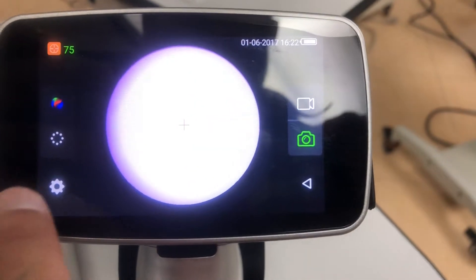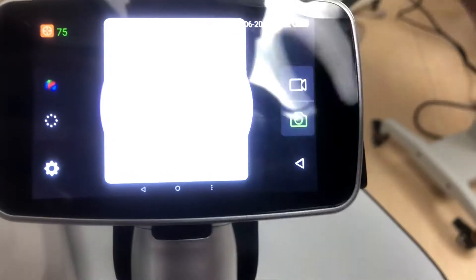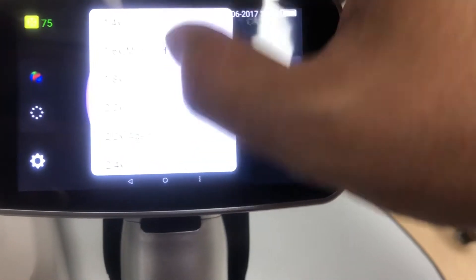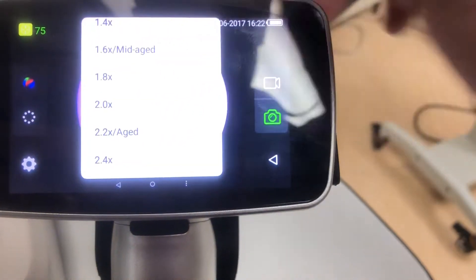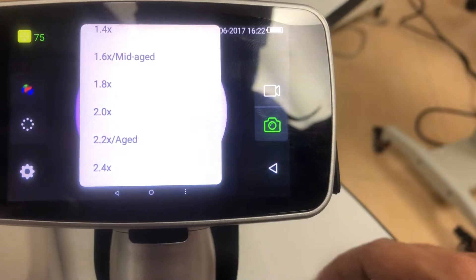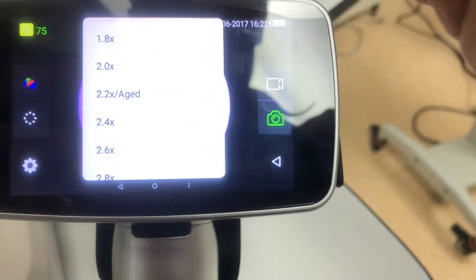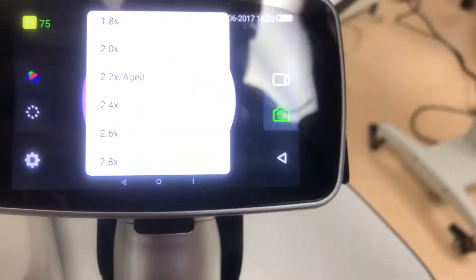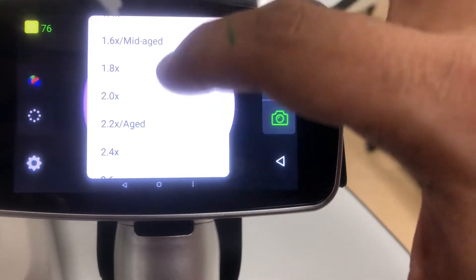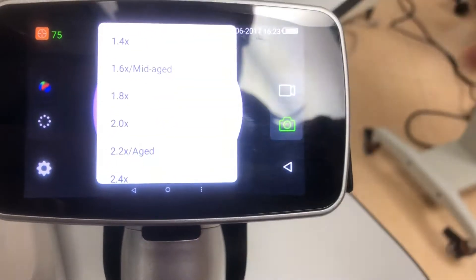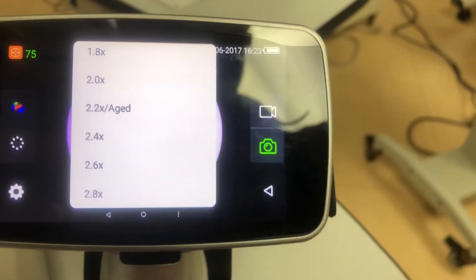It's very important you have capture mode set correctly. There are different capture settings here. The recommendation is where it says 2.2 aged — I would recommend anywhere from 2.2 to 2.8. That's the range you want to be in, as it'll make it easier and will cover all types of ages and patients.